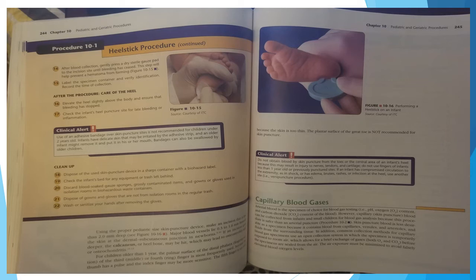Do not use an improper pediatric size skin puncture device. Make an incision that is less than 2.0 millimeters deep. Major blood vessels lie 0.3 to 1.6 millimeters beneath the skin at the dermal-subcutaneous junction in newborns. If an incision goes deeper, the calcaneus or heel bone may be hit, which may lead to osteomyelitis and/or osteochondritis.